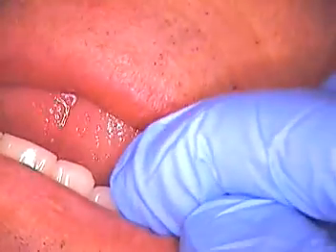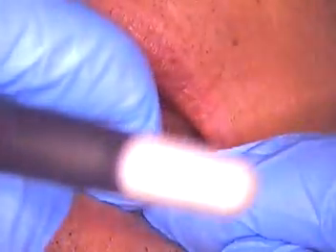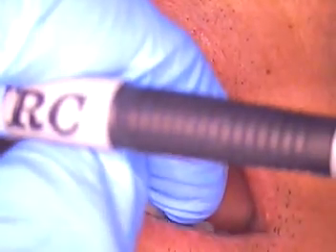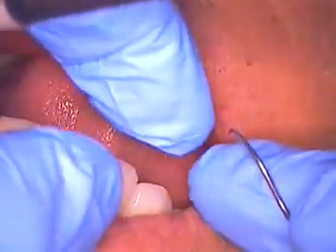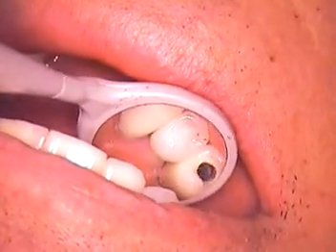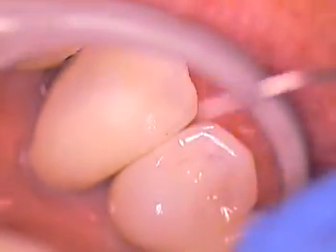I fiddled with this one a lot. It went right in. I spent about half an hour just on that one contact — the lab had it close, but it still was tight. I've got to check margins before I check that. Shape, contours. Zooming in. I want to take this crown out and feel this crown, see if it seats any differently. Nope — didn't move.